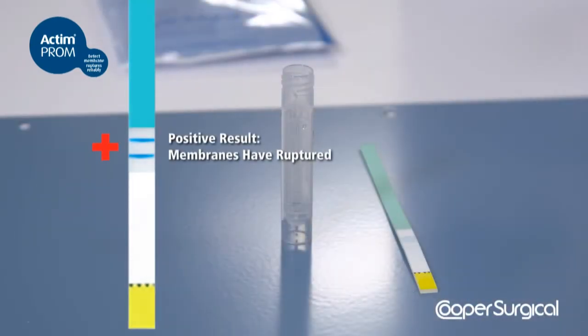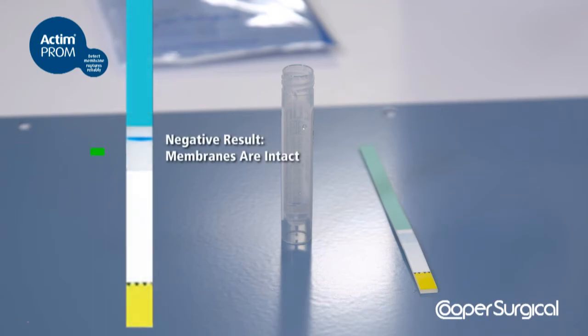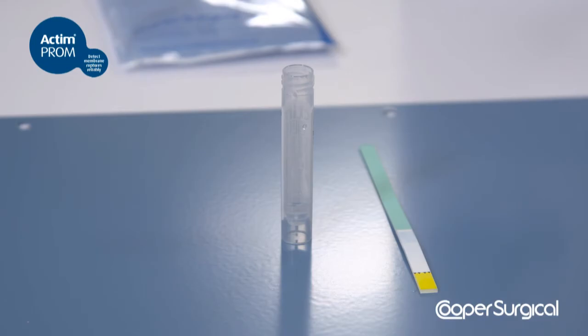A positive result can be interpreted as soon as two blue lines become visible. A negative result should be confirmed at 5 minutes. Disregard any lines appearing later than 5 minutes.